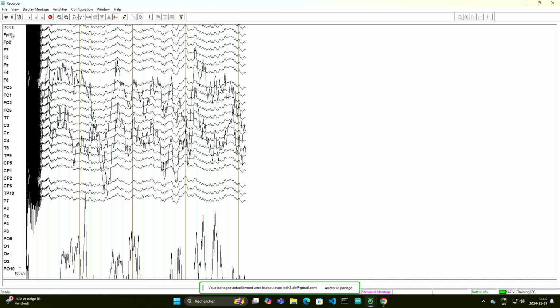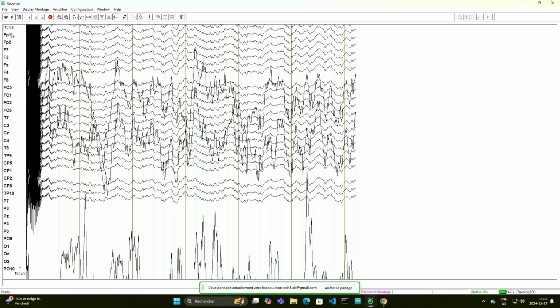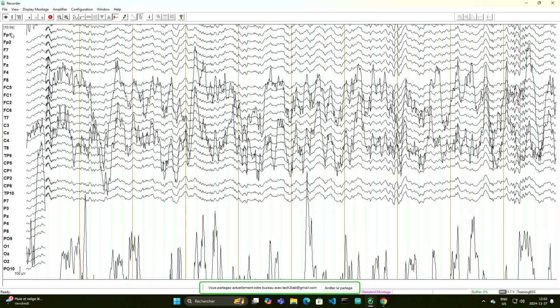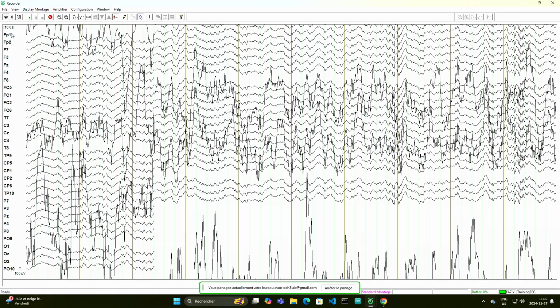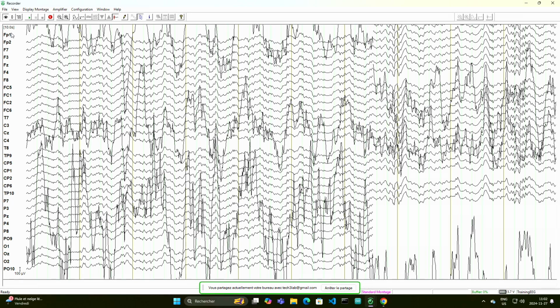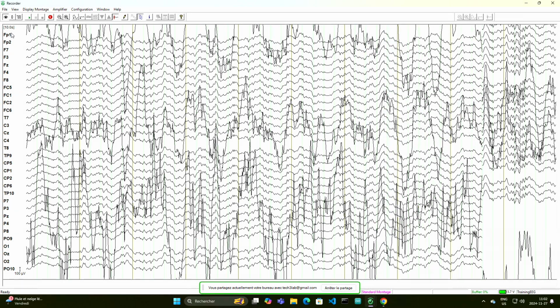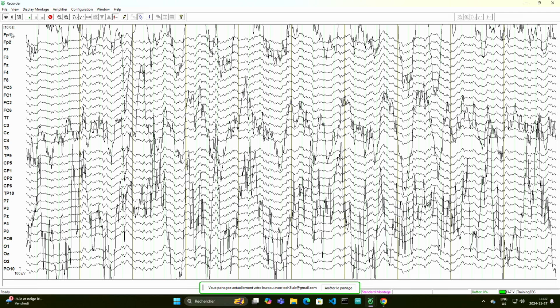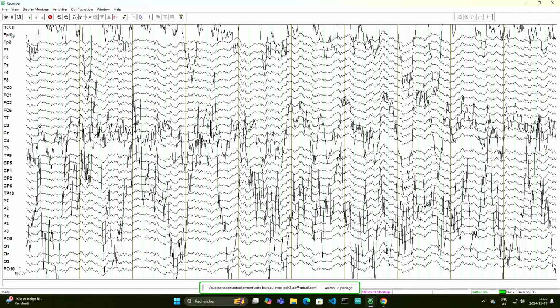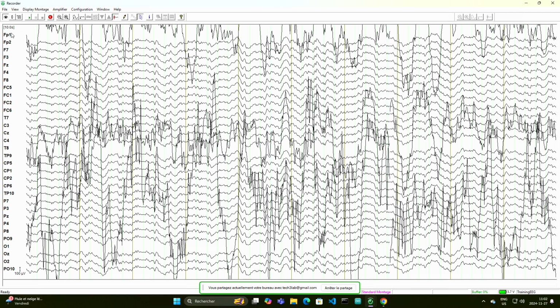Great. Your next step, I want to actually see the signals. So Xavier is going to press the little eye icon there, and we're going to see what the signals look like completely raw. I want to make sure that we don't have any dead channels. If we had a dead channel, we want to know about that beforehand, so we can make a note.